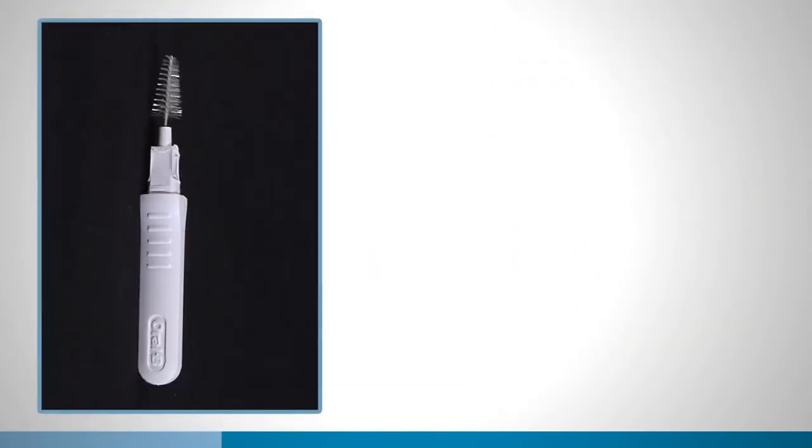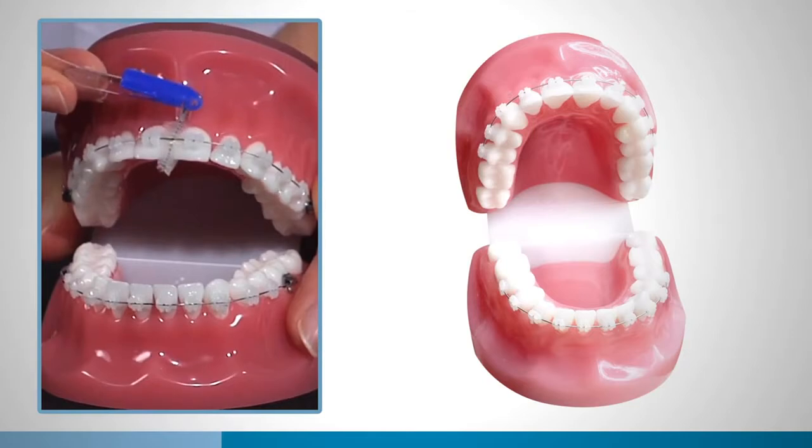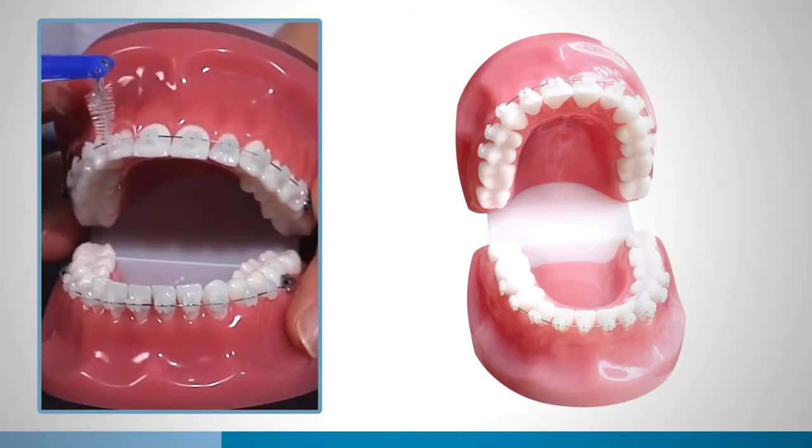Carry proxy brushes with you on the road for those times when you know you won't be able to brush right after eating. They remove the debris quickly from behind your arch wire. That way you don't have to worry about food stuck in between the braces and you'll feel more comfortable.